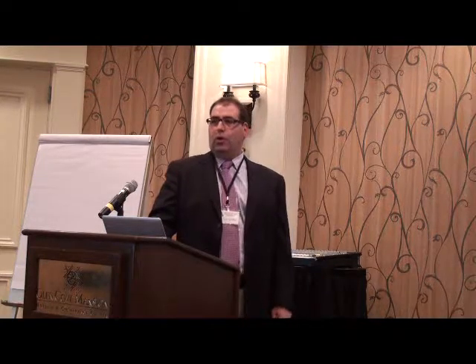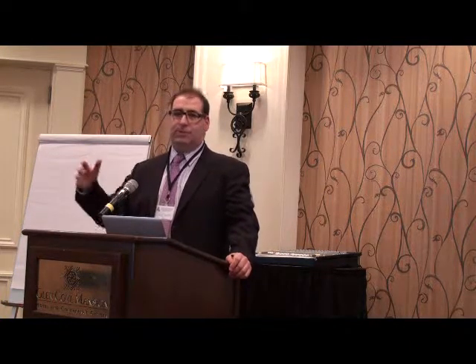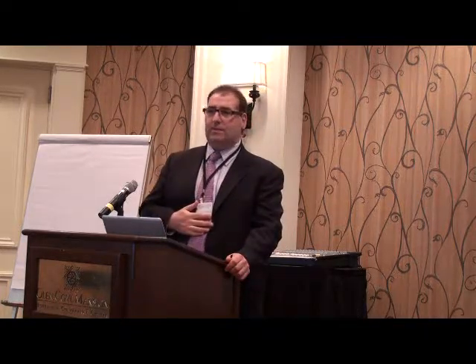Is there pain involved? There most likely is pain. I think we're seeing less and less pain as we're getting more and more super selective. With the embolization procedures, we used to say there's 100% post-embolization syndrome. When you block up a blood vessel in any part of the body, it can result in pain. A patient that has a heart attack complains of chest pain, a blood vessel in the heart gets blocked up.